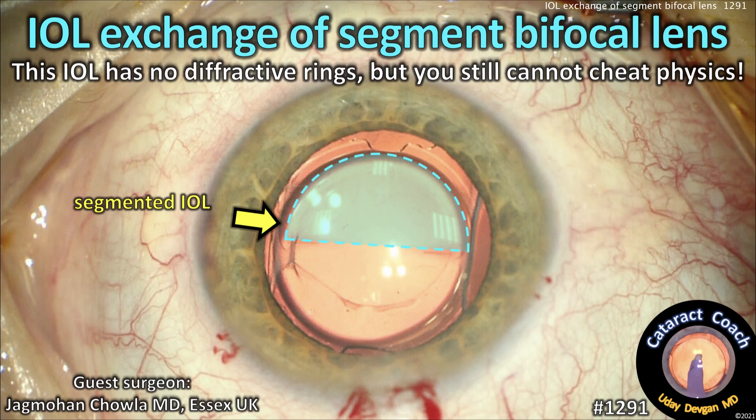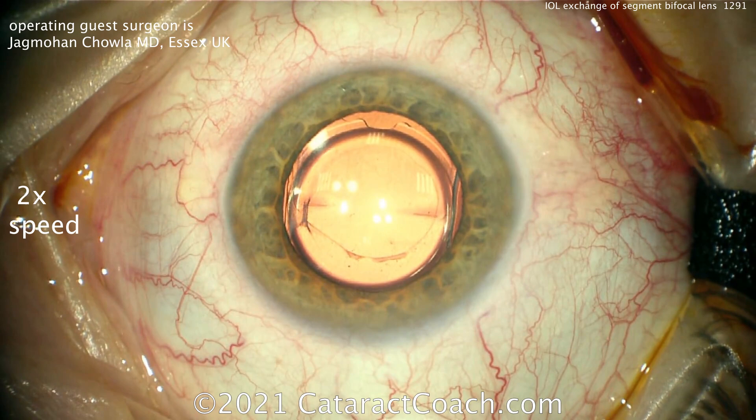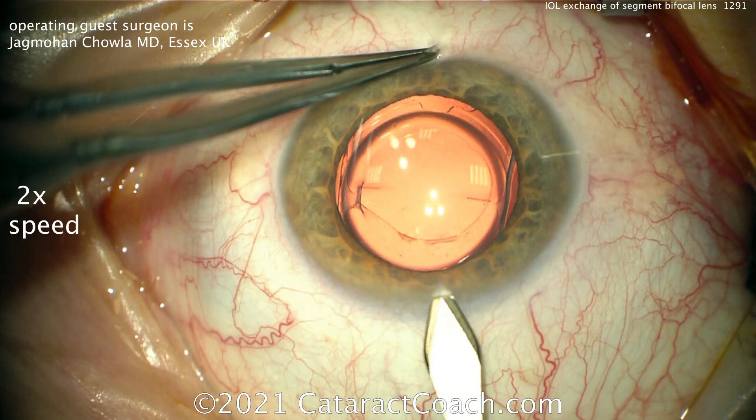CataractCoach.com — IOL exchange of a segment bifocal lens. This lens has no diffractive rings, but you still cannot cheat physics. Our guest surgeon is Dr. Jagmohan Chawla from Essex in the UK.